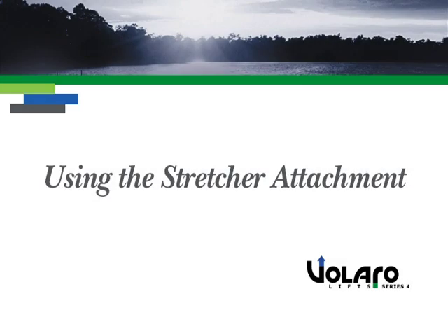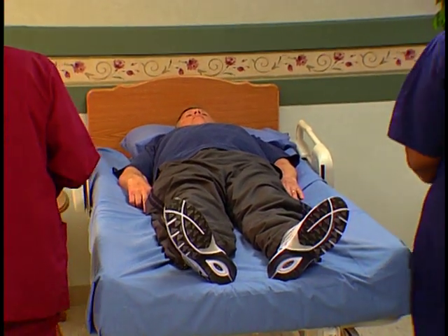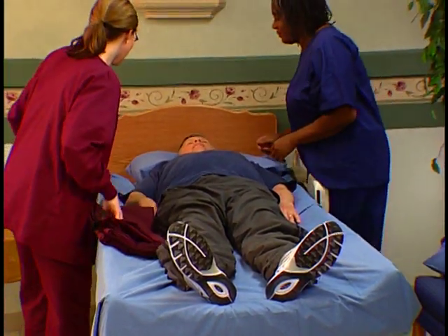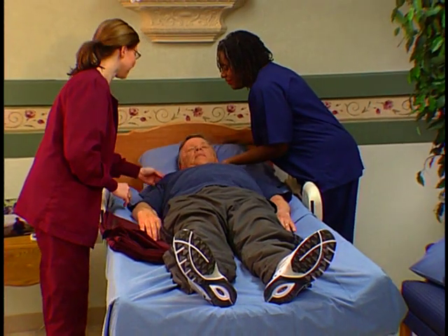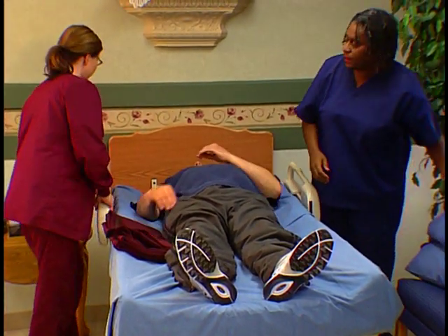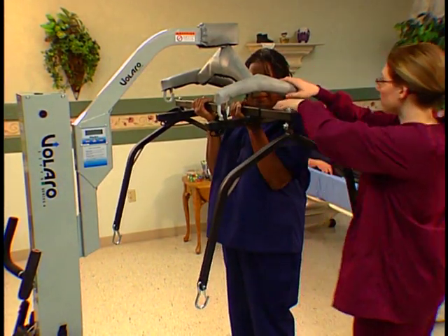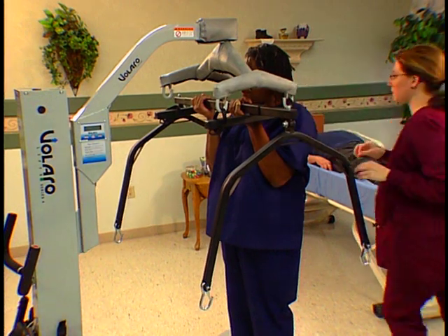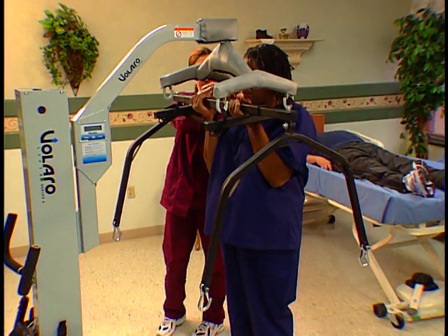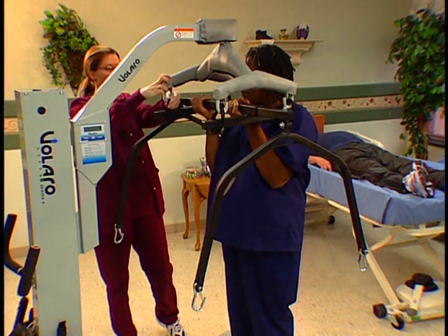Instructions for using the stretcher attachment. After completing your safety and sizing checks, here are the steps to use the stretcher attachment system. First, assess the patient's medical situation by consulting with the patient's nurse. To prep the lift, first remove the stretcher kit items from the carrying bag. Observe the black nylon loops on the stretch frame. If they are frayed, do not continue with the lift.